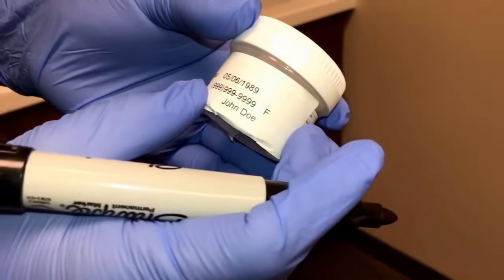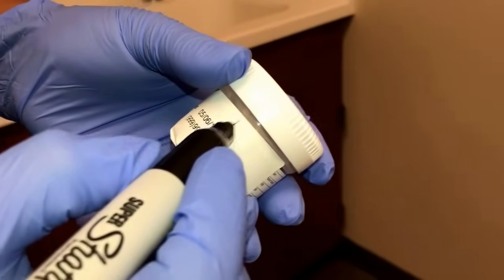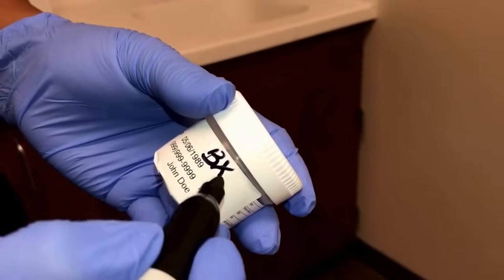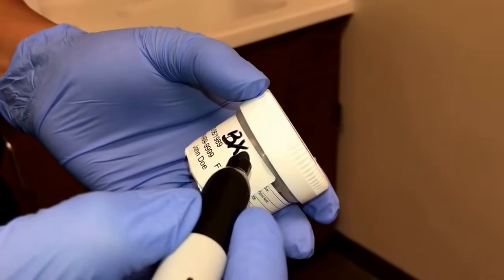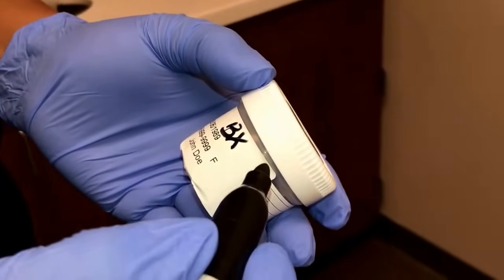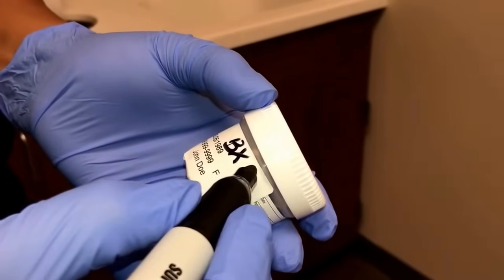After the specimen is placed into the vial, you will then write BX, which stands for biopsy, and the provider will tell you the location of that specimen — whether it's 12 o'clock, 1 o'clock, 2 o'clock, etc. This one was taken from 1 o'clock.